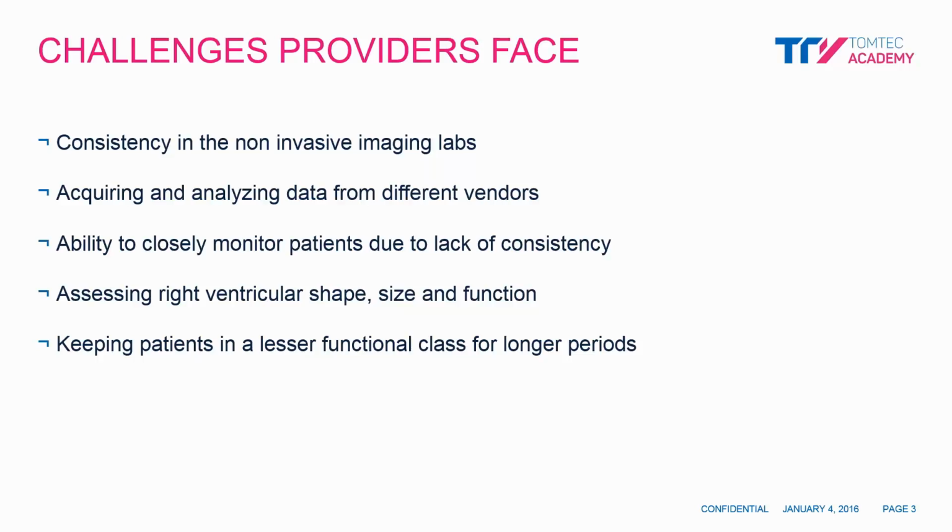initiated. In today's busy echo labs, it is not uncommon to have different ultrasound carts from different vendors, and/or to also have the same vendor, but each cart on a different software version. These concerns can create an inconsistent environment that users oftentimes have no control over. The sum of these issues can be that we lose the ability to closely monitor patients suffering from pulmonary hypertension and therefore lack consistency.